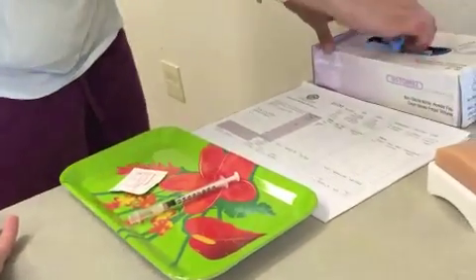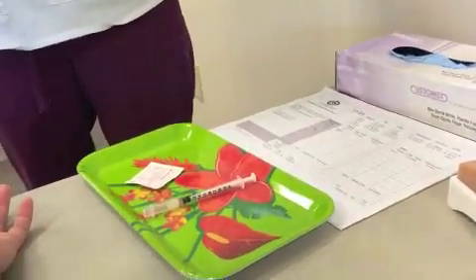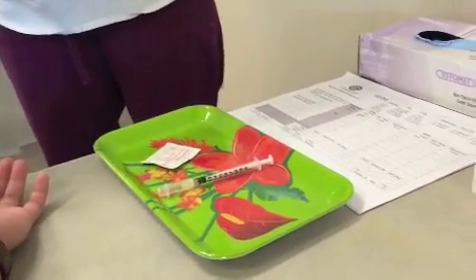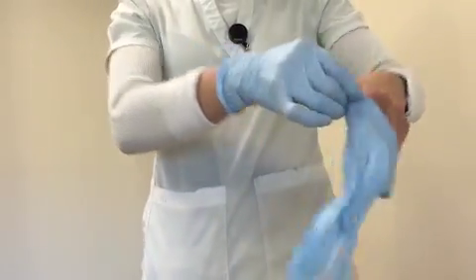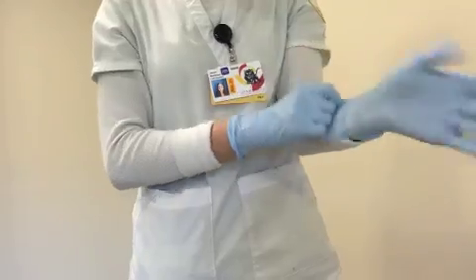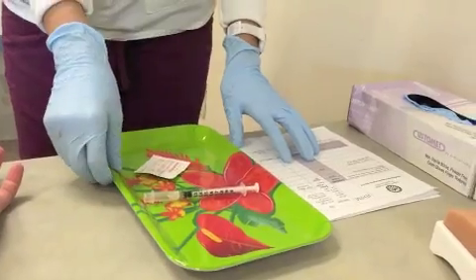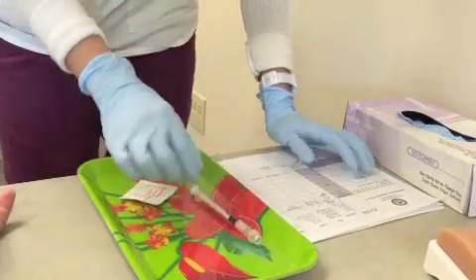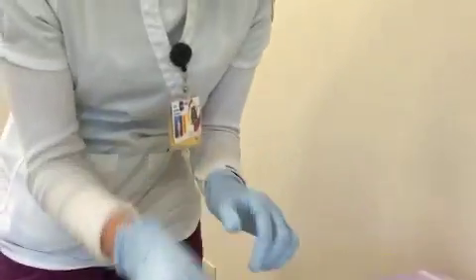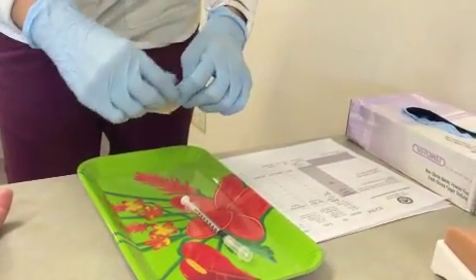So now you're going to put gloves on. Look at your MAR again. Make sure you have the right patient, the right drug, which is the PPD. You have 0.1 milliliters. And you're going to do an intradermal.